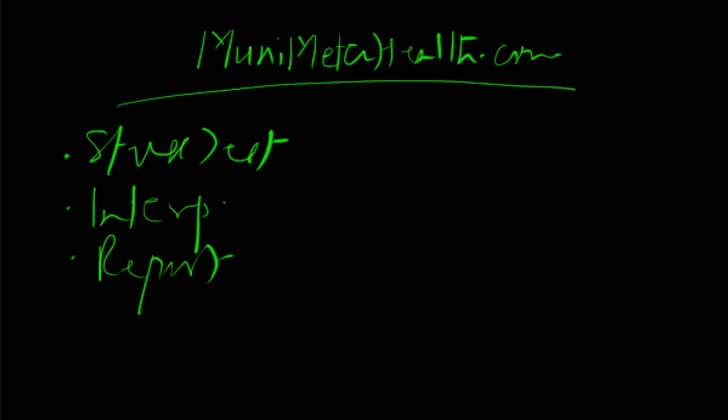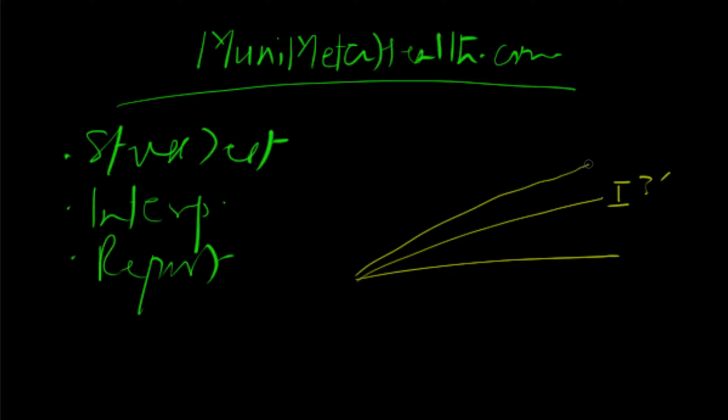So basically we are looking at, as I said, a treadmill test that's being performed by the individual here. You have an incline and you have a set speed. So the treadmill stress test is being performed. Every stage is roughly about 3 minutes. It's programmed to go higher on incline and higher on speed, and therefore now this is stage 2. There's another 3 minutes added to it. Then you have another stage 3 here where another 3 minutes is added, and so on and so forth.